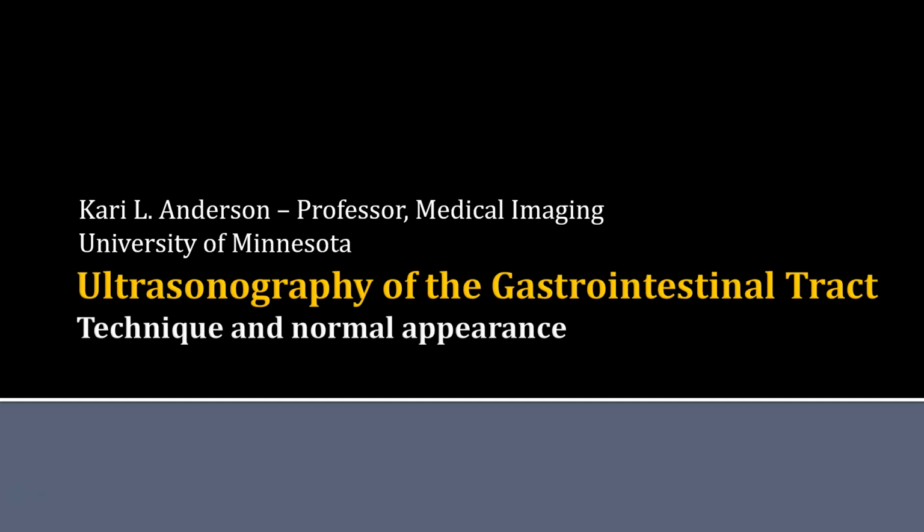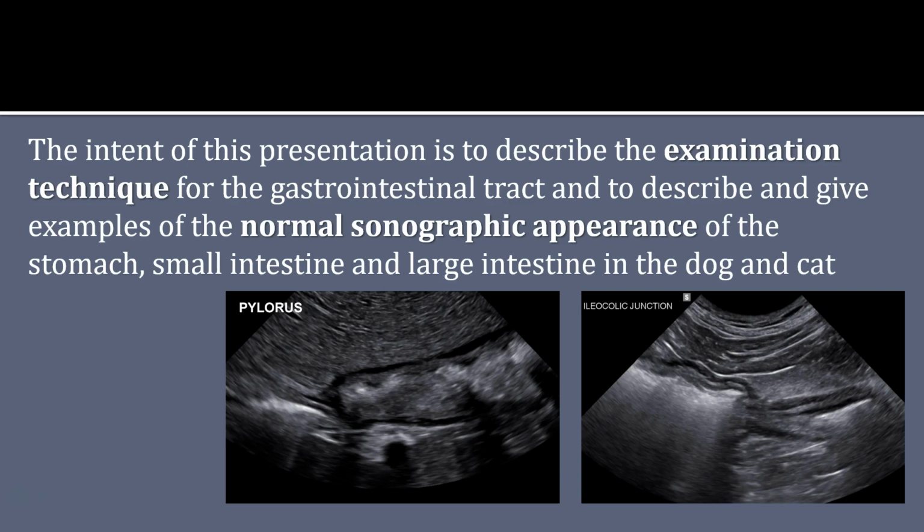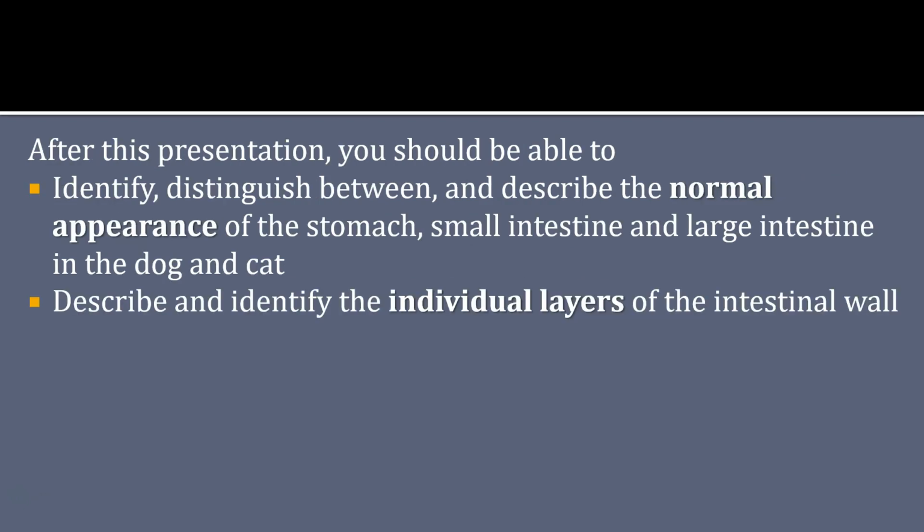Welcome to the first in a mini-series on ultrasonography of the GI tract. This presentation will describe the examination technique and describe and give examples of the normal sonographic appearance of the stomach and small and large intestine in the dog and the cat.